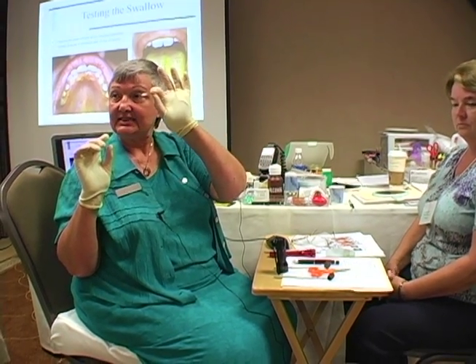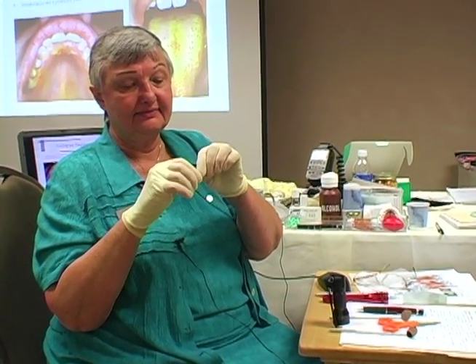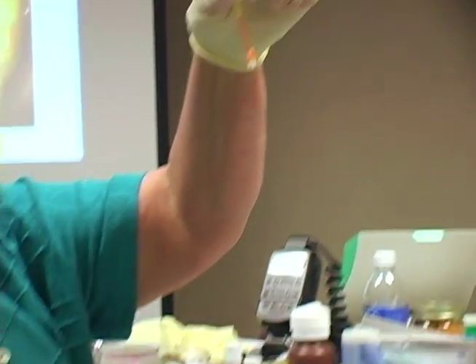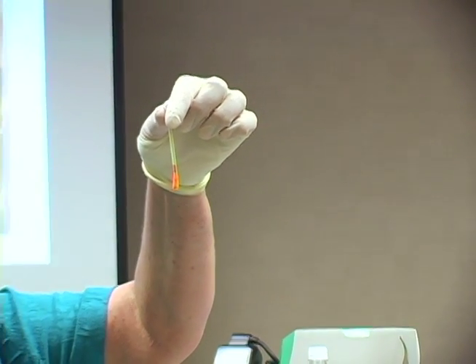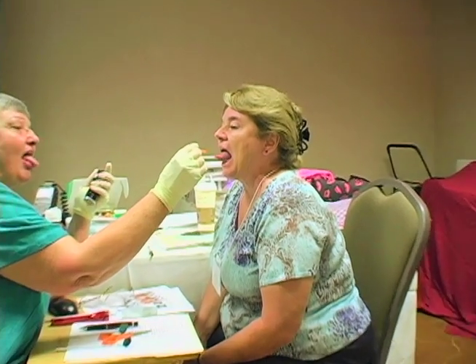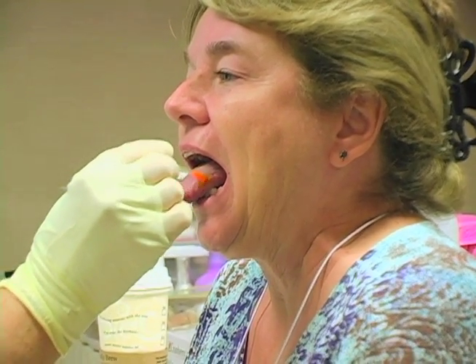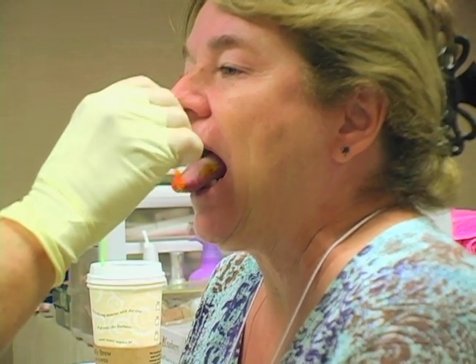This one is sweet. You just break this glass — there's a little line here — and you break it at that point. The dye is used to put all over the teeth to see if there's any plaque. We're going to do the exact same thing: bring your tongue forward and just put a dot where you would place the squares of the other dye.